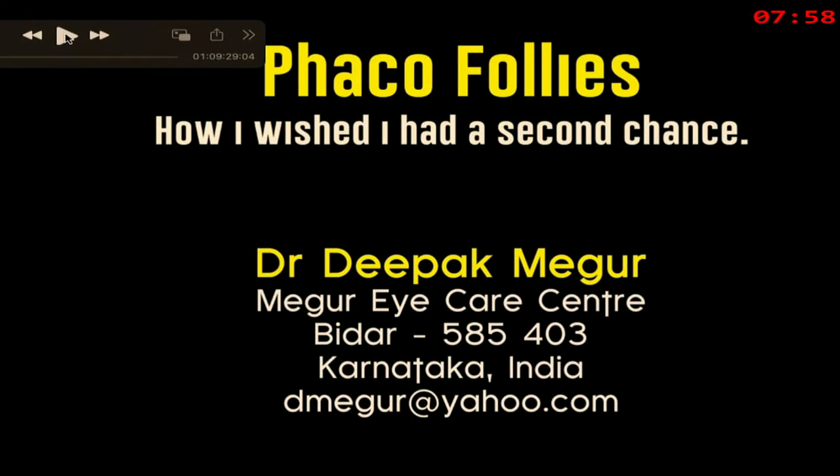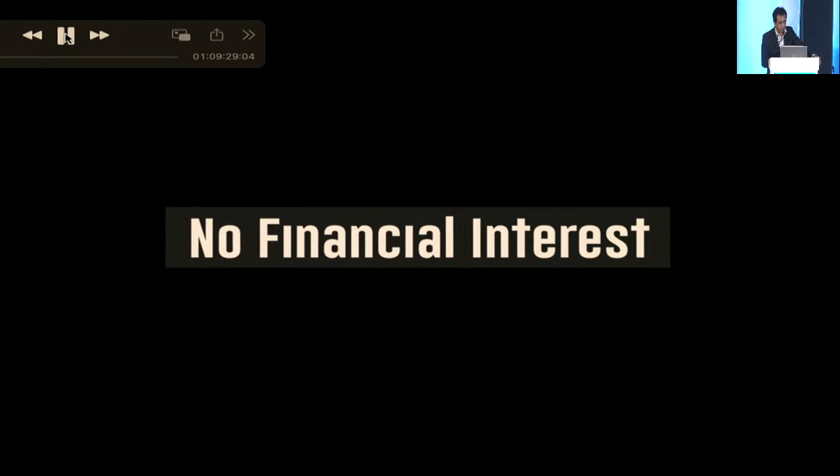Thank you, Rishi. Just wanted to clarify, because of a slip of the tongue from Dr. Nivian, the haptic IOL sticking is seen exclusively with the hydrophobic lenses because of the sticky nature, and not the hydrophilic lens. That's what he meant, I'm sure. And I just wanted to bring it to the notice of everyone, okay.